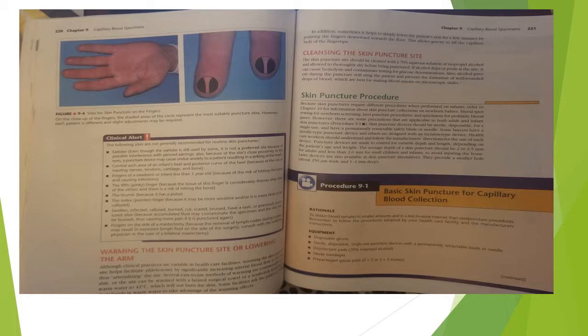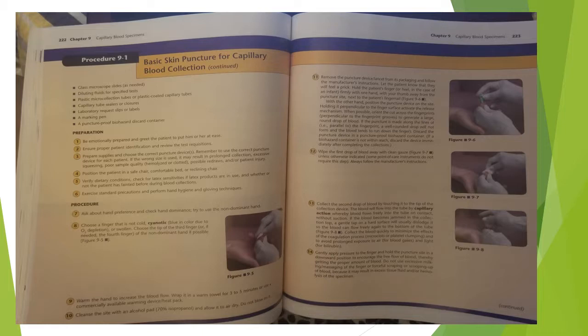Equipment: disposable gloves, sterile disposable single-use puncture devices with a permanently retractable blade or needle, disinfectant pads, sterile bandages, prepackaged gauze pads, 2x2s or 3x3s. Glass microscope slides as needed, diluting fluids for specific tests, plastic micro collection tubes or plastic coated capillary tubes, capillary tube sealers or closures, laboratory request slips or labels, a marking pen, a puncture-proof biohazard discard container.